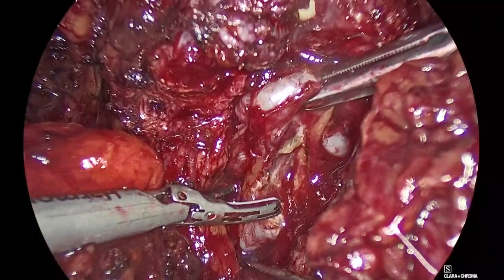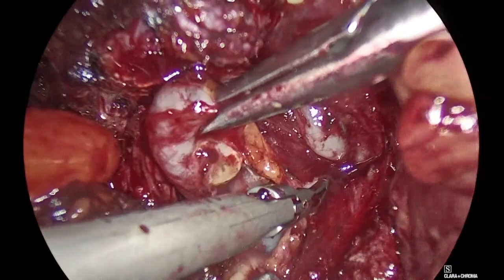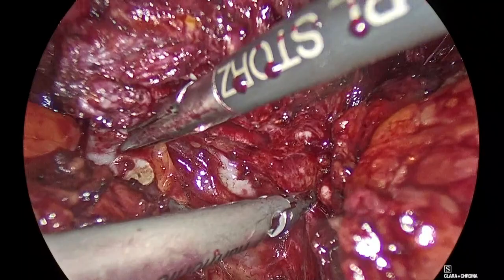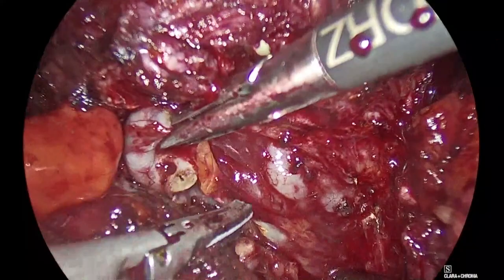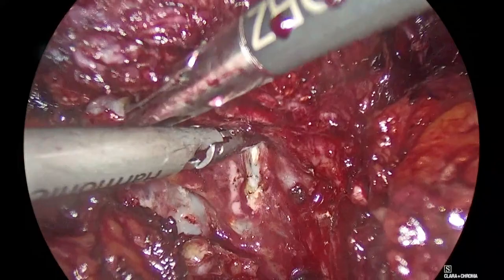This is my vas, the vas on my side, eh? Probably, I think. Come closer. Good. Okay. See how important it is. It's a traction game here, eh? Traction one side, traction the other side. So when I'm working on the right side, Panayotis is pulling the whole thing on the contralateral side, on my side.